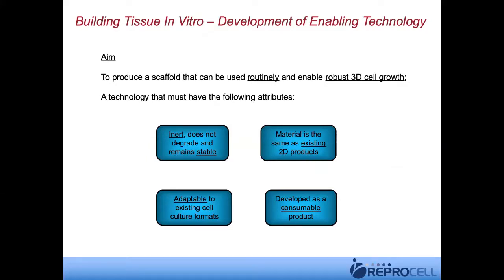So we set about developing a technology that can enable us to grow cells in 3D and build tissue in vitro. And it had to be a technology that enabled us to be able to do this routinely and robustly. So this is a scaffold-based approach.